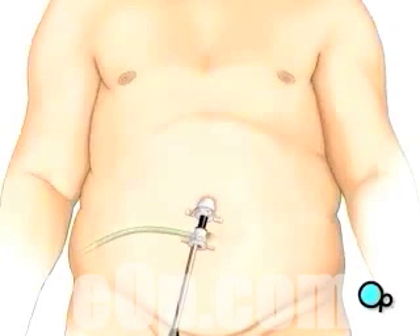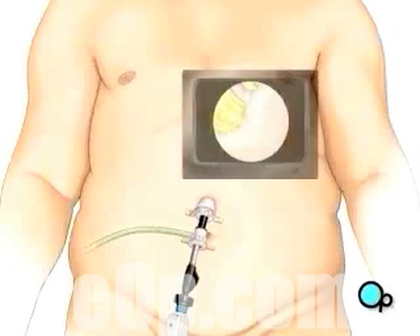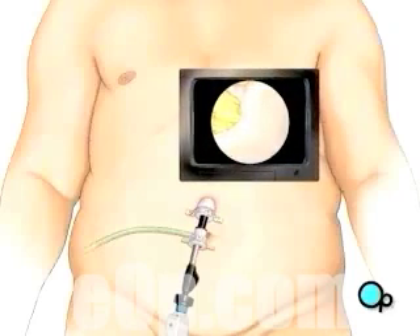The team then inserts the laparoscope. Once in place, the laparoscope will provide video images that allow the surgeon to see the inside of your abdomen.